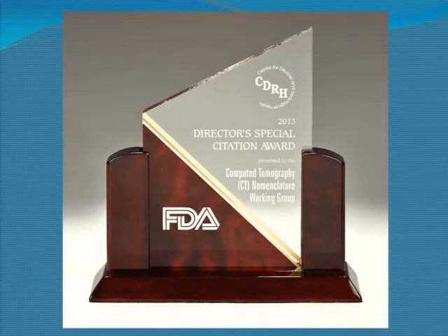I was wondering about the dose alert software that goes with the new scanners. Is that something that is optional, which means that you have to pay extra for it, and likewise an annual fee for it? My understanding is that it comes with the scanners, that the FDA sort of made that not optional. All the scanners past a certain vintage will have it, and it will be set with that 1 gray limit. And if you never want to look at it, other than that, you don't really have to until you hit that 1 gray limit, and then you're going to be in a bad way. But as far as I know, there's no annual fee or anything else associated with it.